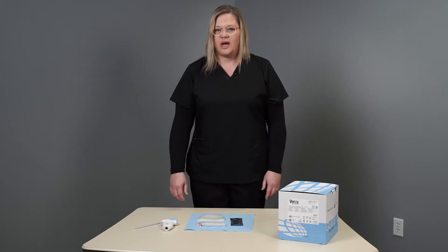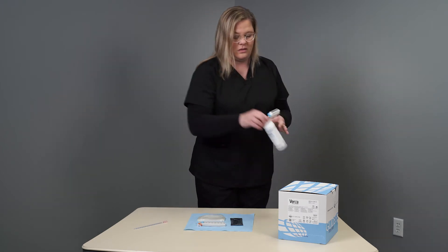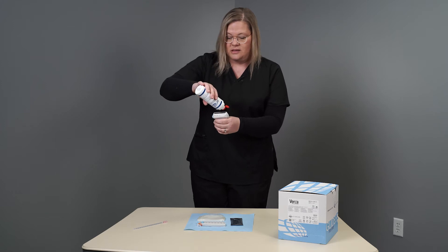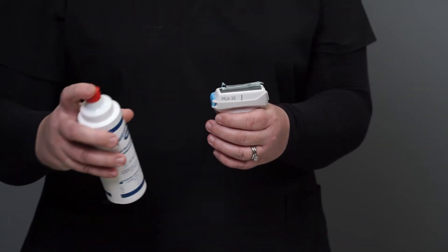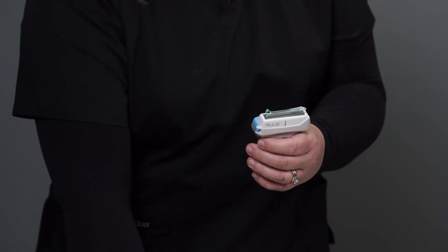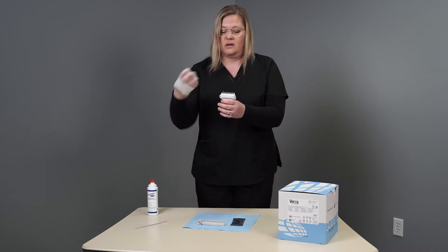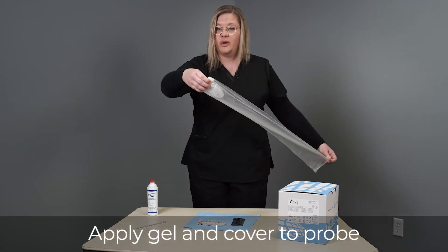Now I will walk you through how to prepare the probe. The first step will be to apply gel to the probe lens. Next, take your probe cover, apply it over top of the gel, and deploy it down your cord.